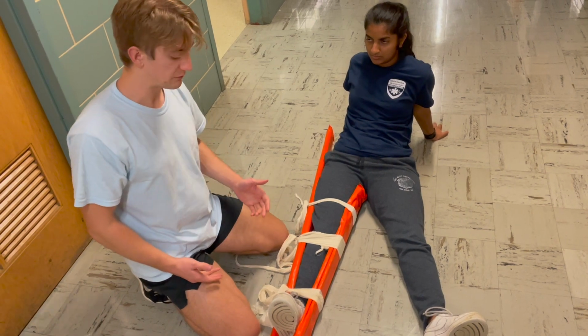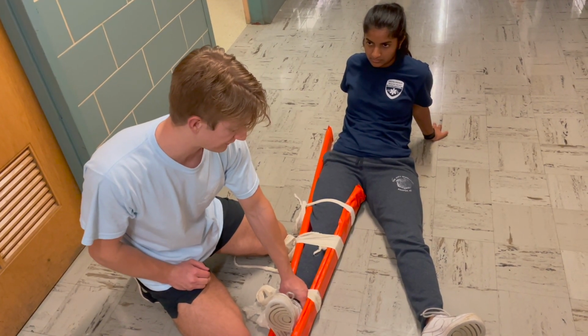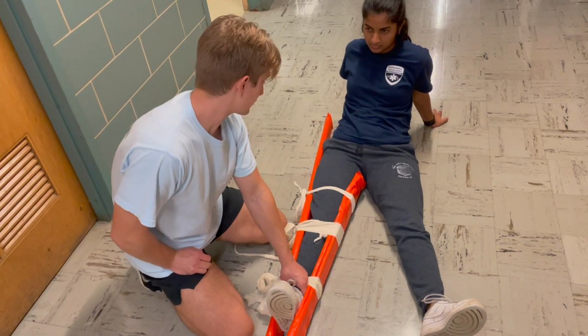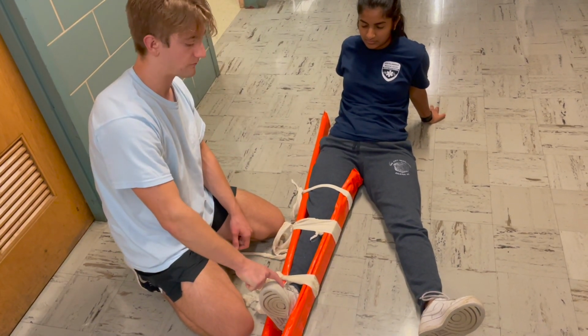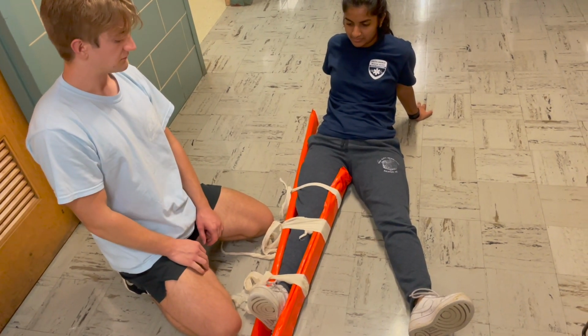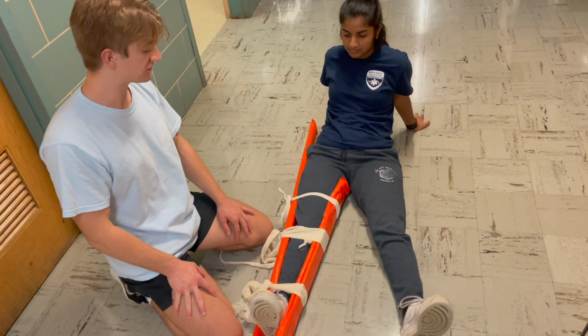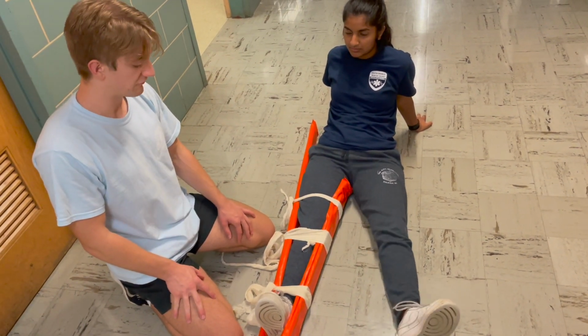Of course, we're going to finish with PMS because that's important after any circumferential treatment. So I'm going to feel for a pulse. I'm going to ask you to close your eyes and tell me which toe I'm touching. My big toe. Yep, and I'm going to ask you to move your toes for me. Okay, so at this point, once everything is secure, we can also release manual stabilization, and we can load our patient up for transport.